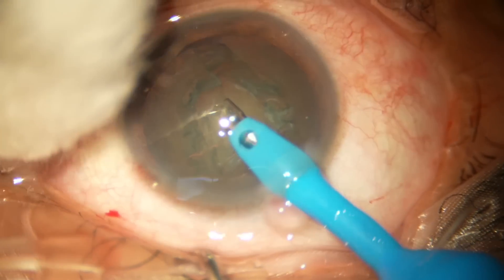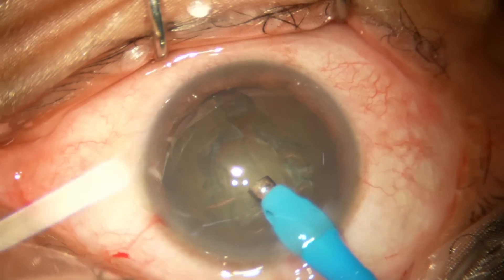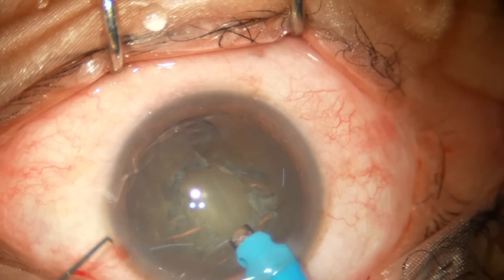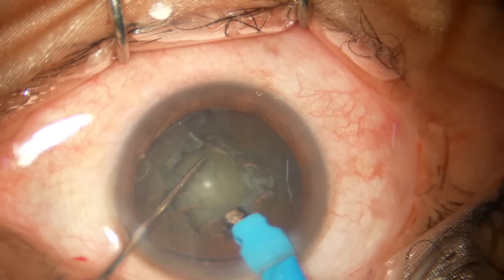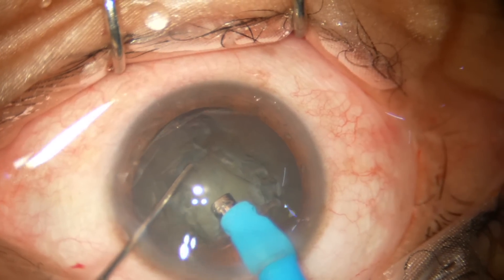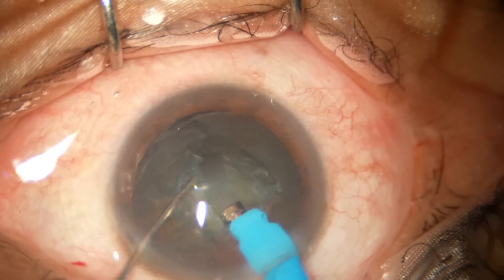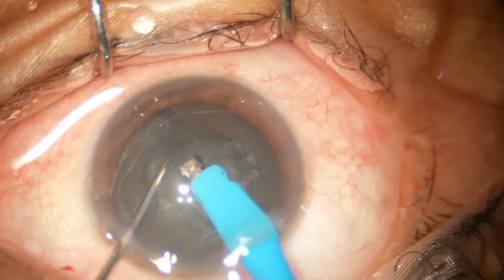I go in, aspirate some cortex, turn the handpiece to make the bevel up. I select the side toward the center and make a trench. Appropriate amount of power does not push the nucleus — I apply all the sonic energy to cut the matter in front and move forward; the lens mass doesn't move.